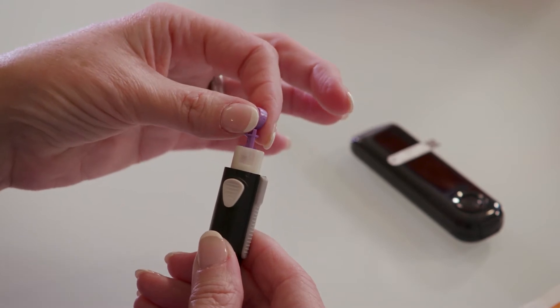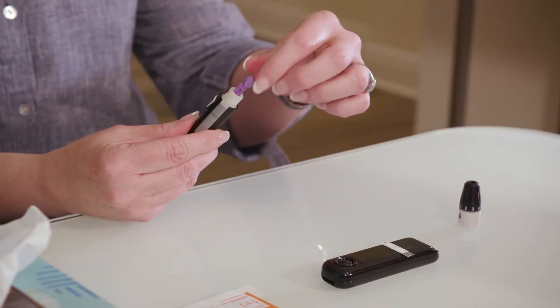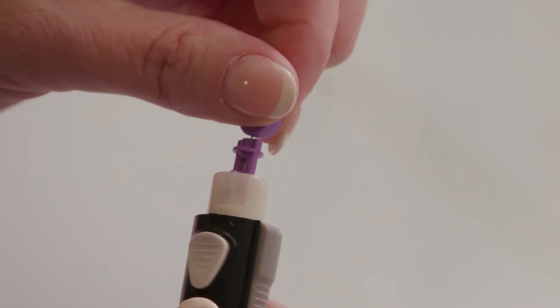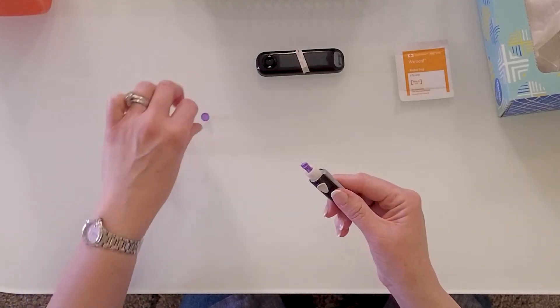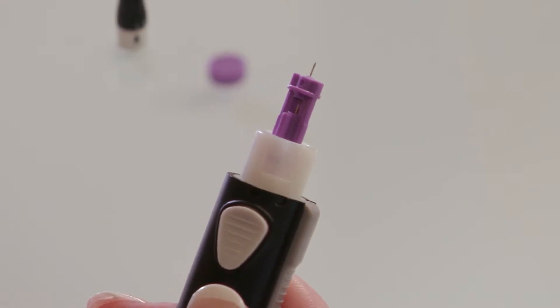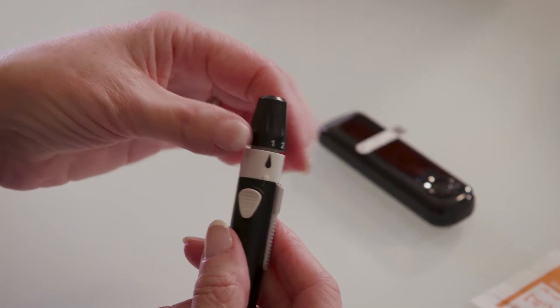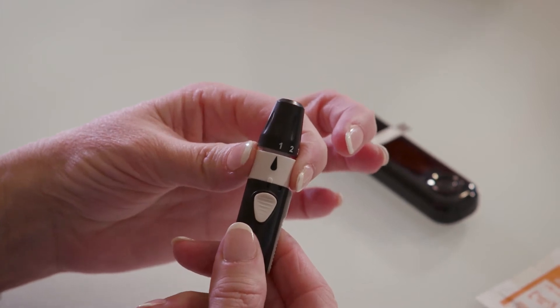Push the lancet all the way down until it can't go any further. Carefully twist the round tab three times, being careful not to bend it. Pull it off and set it aside to use later. You should see a small needle inside the lancing device. Put the end cap back on in the unlocked position and twist the white band back to the locked position.